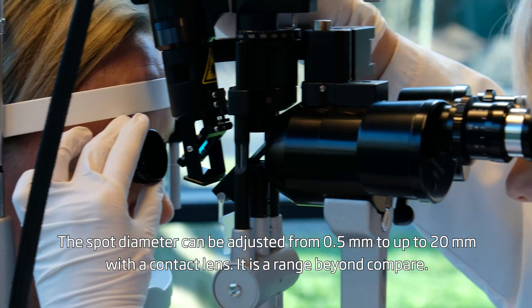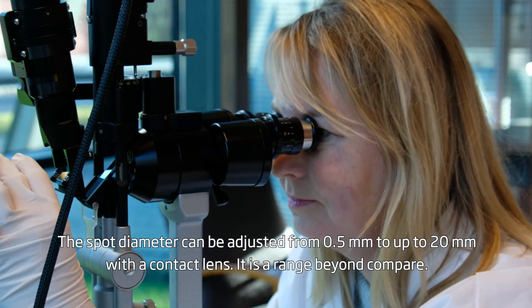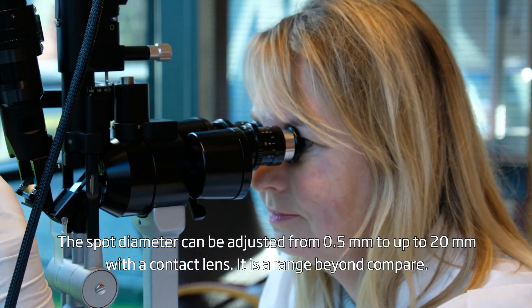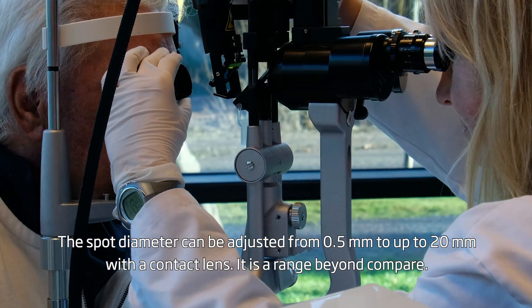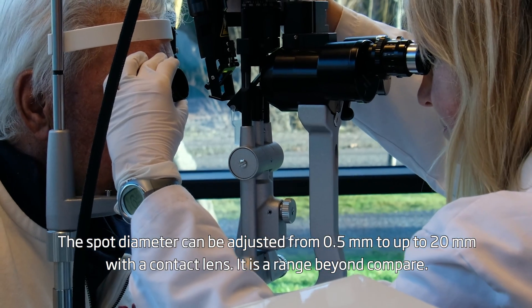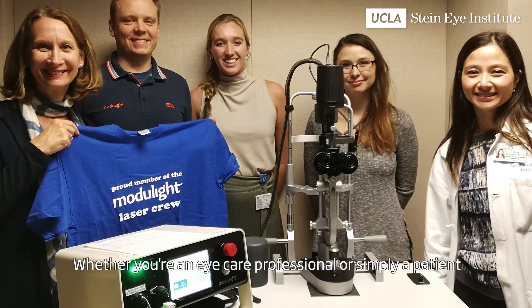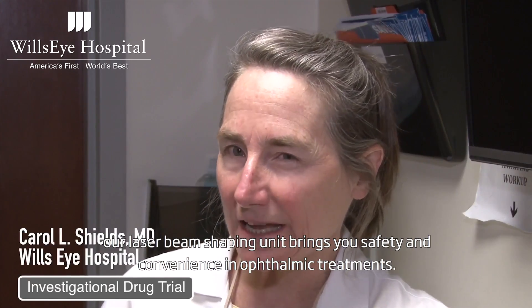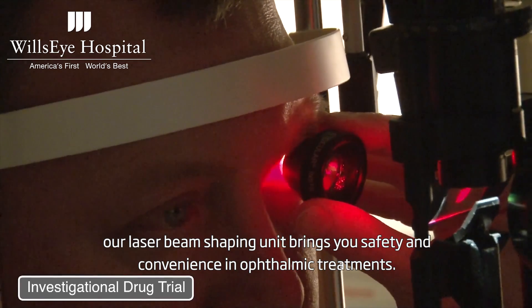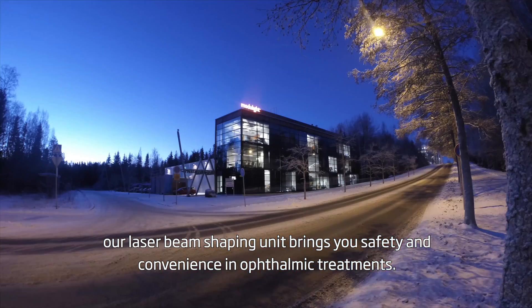The spot diameter can be adjusted from 0.5mm to up to 20mm with a contact lens — it is a range beyond compare. Whether you are an eye care professional or simply a patient, our laser beam shaping unit brings you safety and convenience in ophthalmic treatments.